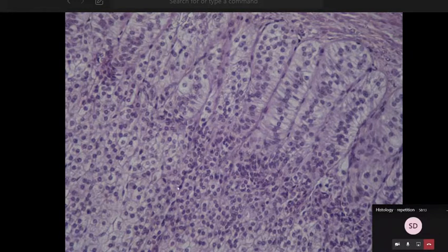This is the zona fasciculata. Here, blood vessels run straight, they do not have an arch-like appearance, but they run straight. And along the blood vessels, the endocrine cells are oriented. These endocrine cells from the zona fasciculata are also called spongiocytes, and probably you should know it.